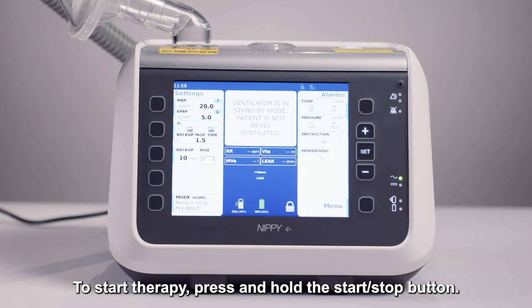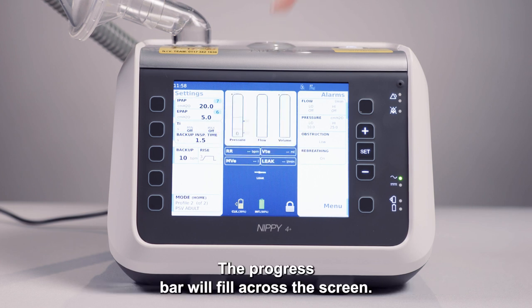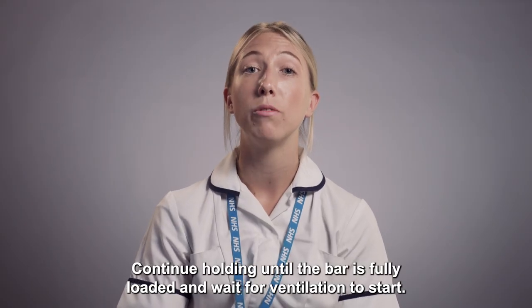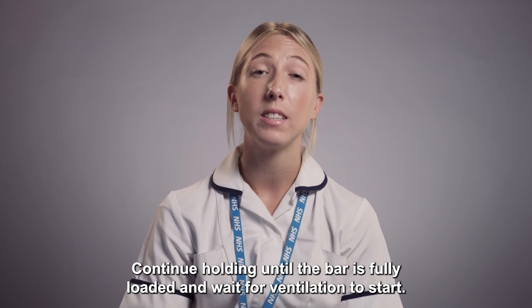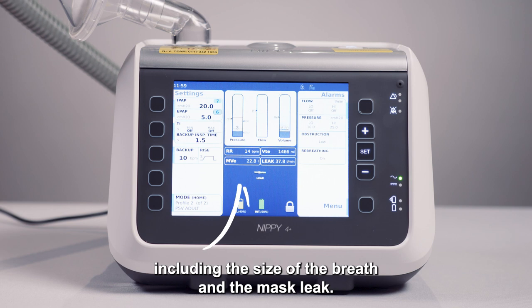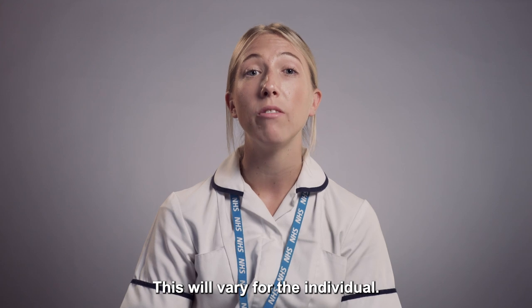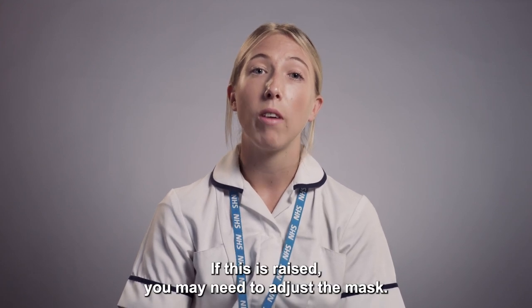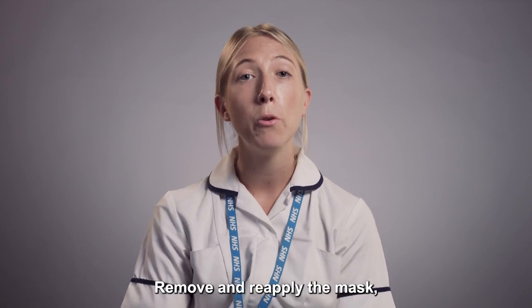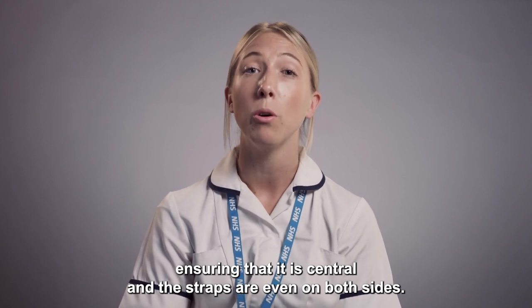To start therapy, press and hold the start stop button. The progress bar will fill across the screen. Continue holding until the bar is fully loaded and wait for ventilation to start. Numbers will appear in the centre of the screen, including the size of the breath and the mask leak. This will vary for the individual. If this is raised, you may need to adjust the mask. Remove and reapply the mask, ensuring that it is central and that the straps are even on both sides.